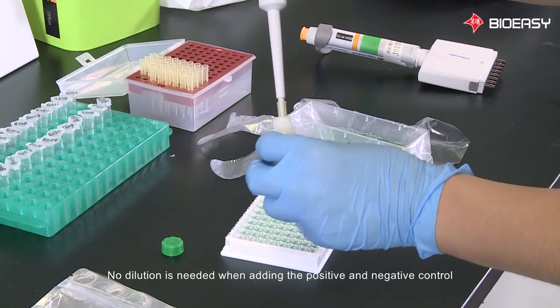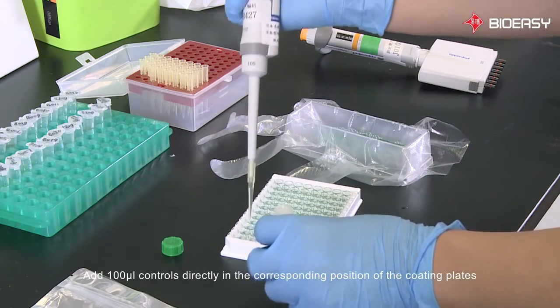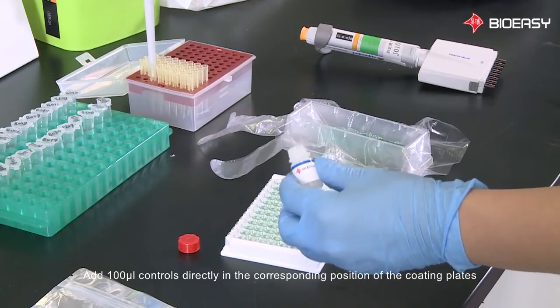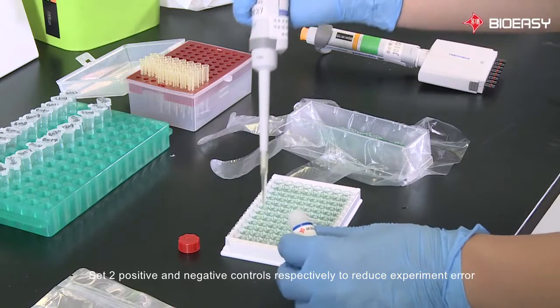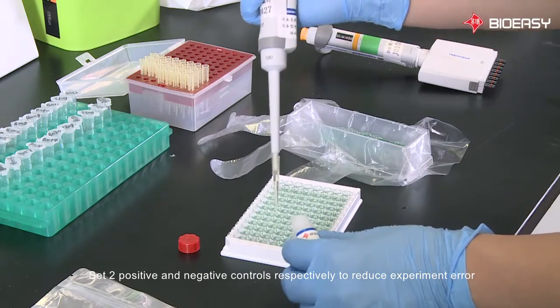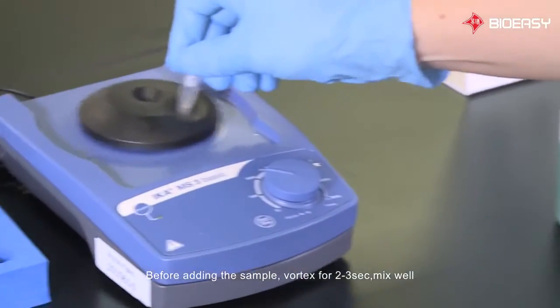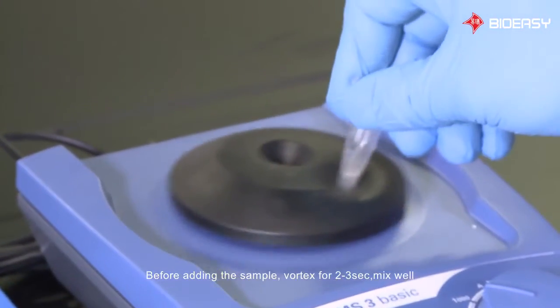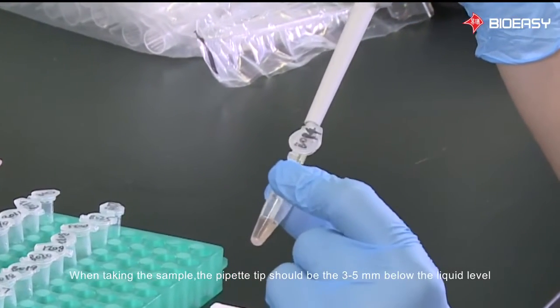No dilution is needed when adding the positive and negative controls. Add 100 microliters of controls directly into the corresponding positions of the coating plates, setting positive and negative controls respectively to reduce experiment error. Before adding the sample, vortex for two to three seconds and mix well.